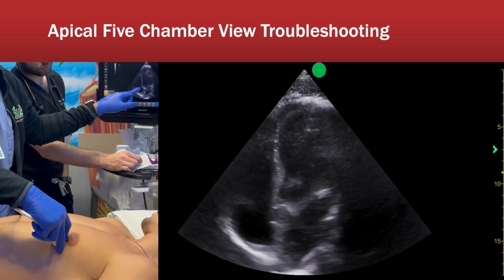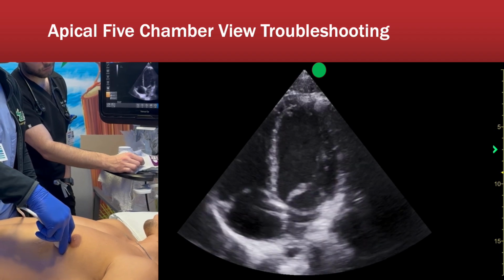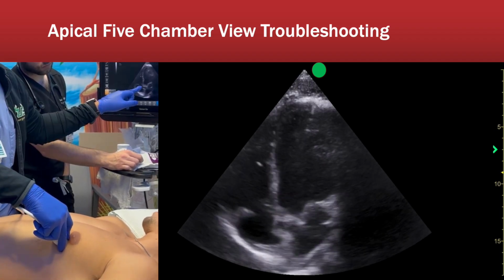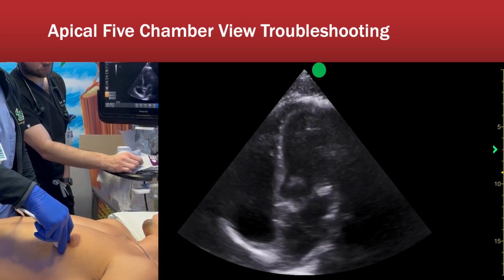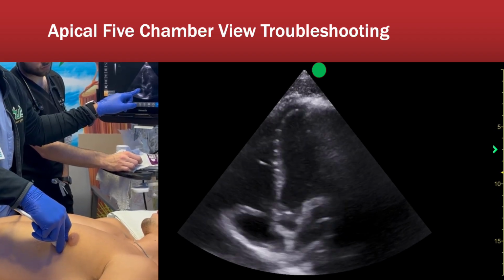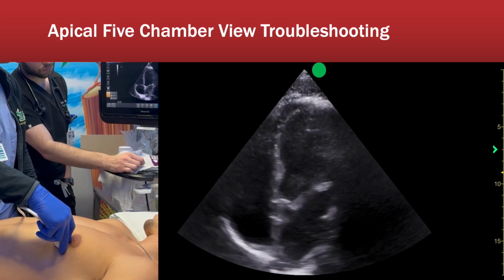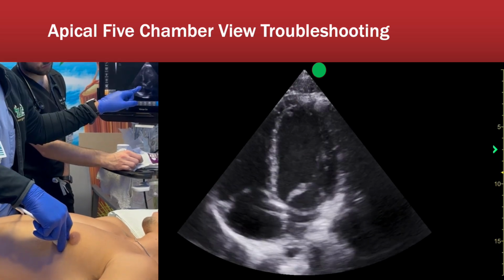Easy peasy. If you have an apical 5-chamber, like we did 2 seconds ago in this view, all that means is you probably have your hand way too flat, or the tail is way too far down towards the feet of the patient. So all you have to do is a slight, maybe 5 to 10 degree tilt of that tail towards the cephalad position, just like you see here.